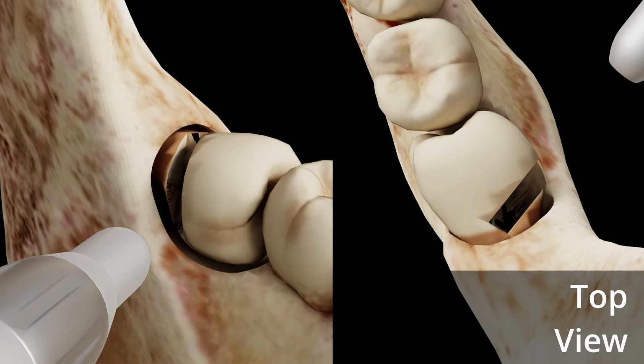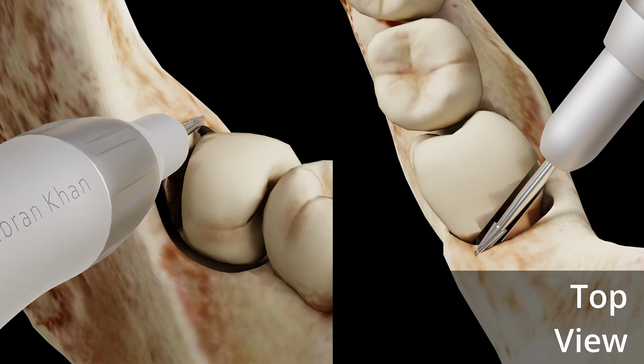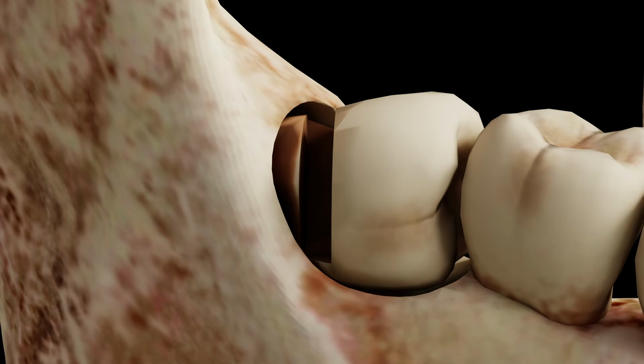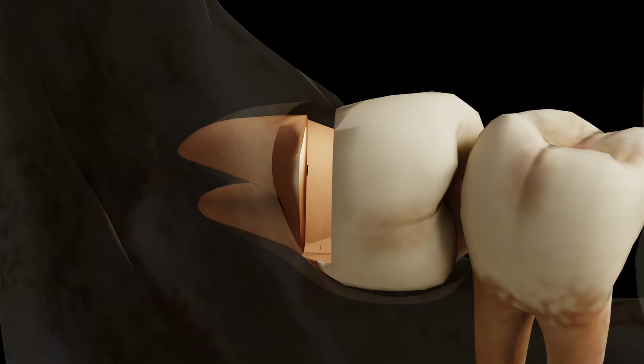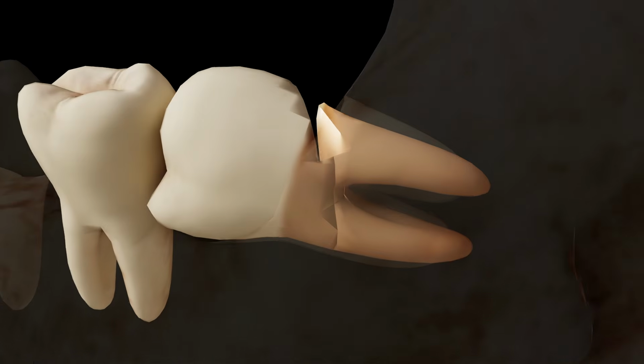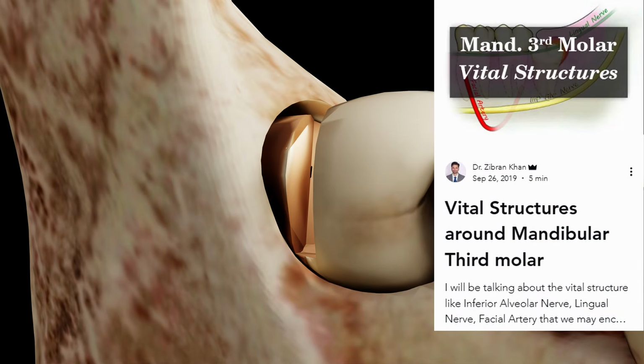Now with the wider section, it will be easier to access the lingual half of the tooth with the 702 burr. The section that I created is a little dark and we cannot see inside the section. Let's brighten it up. You can see that 1 to 2 mm tooth structure is intact on the inferior side and the lingual side of the tooth. This is done to prevent injury to the inferior alveolar nerve and lingual nerve. For more details on this, you can read this article.